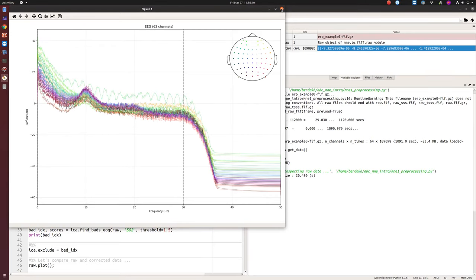Another function is plot_image(), which generates a heatmap or color-coded representation of amplitude values from the averaged data. We can also visualize the ERP distribution showing all channels with some increase in amplitude. You can select specific channels like CZ, FP1, PO10, and SO2 — those last ones correspond to electrooculogram sensors that record eye movement by placing electrodes near the eyes. We use those data to detect eye movement related artifacts.